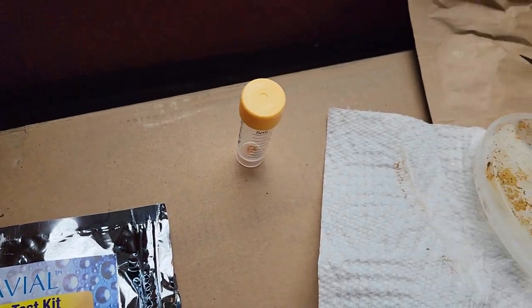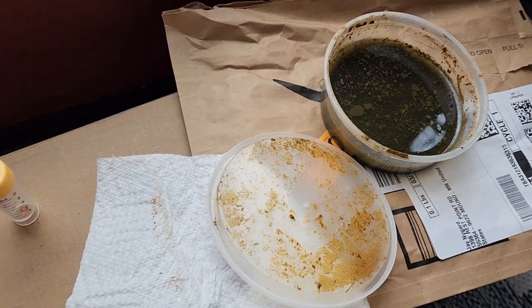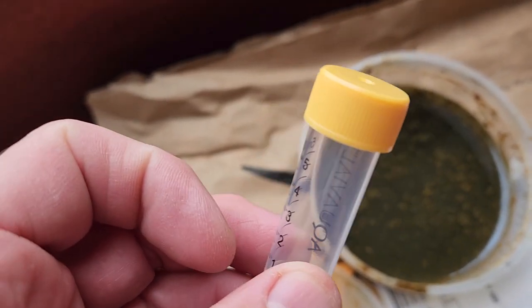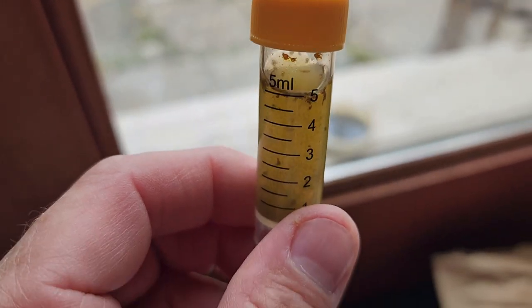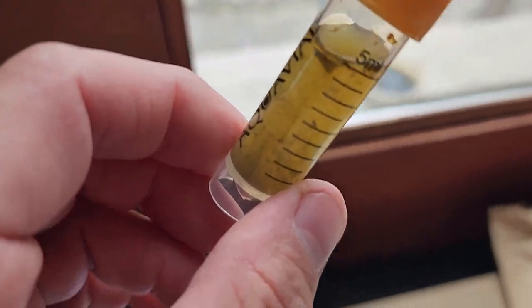I'm going to use one of these here and one out at the landing. I opened my water up that I got from there — oh my god, does that stuff stink! I'm going to have to figure out how to get the water in here without touching the actual water myself. Now we can see it's not really a very clear color, which isn't helpful. I'm going to shake it up anyways.